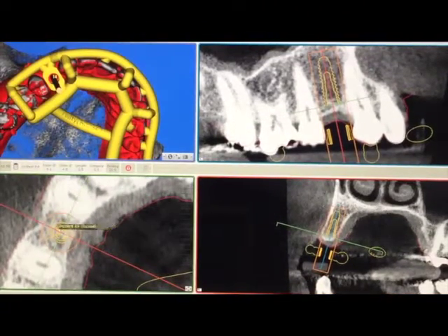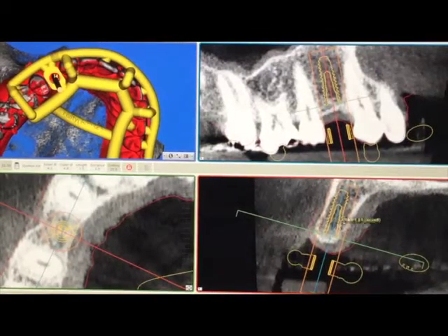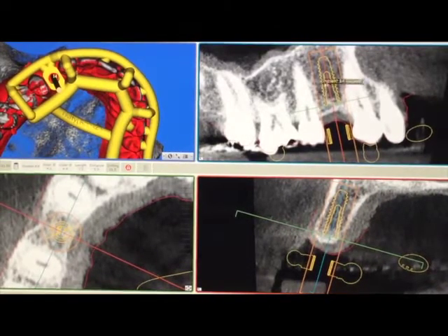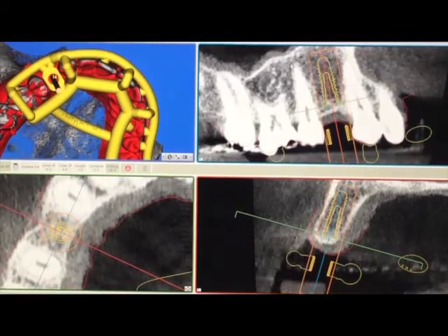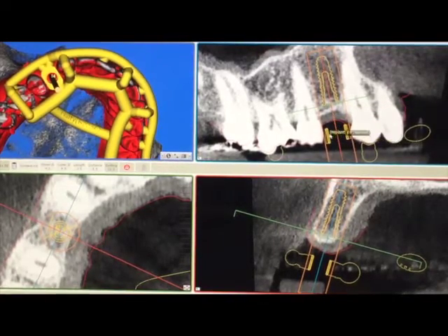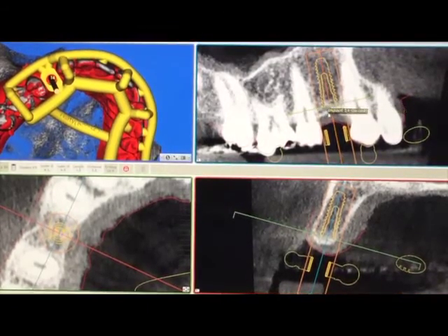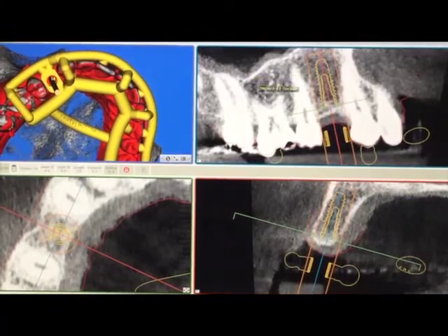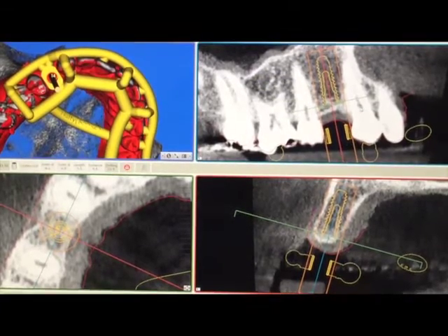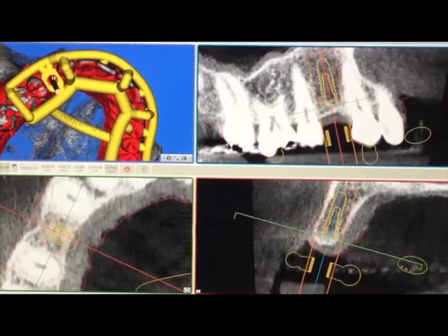So obviously I've placed it a little bit more palatal to give us a little bit more buccal bone, which there's plenty. And we designed this position here. Now I've designed this position here to give us enough height for a good emergence profile, and you'll see at the end how accurate the end result is with the post-op radiograph, and we can compare the two.